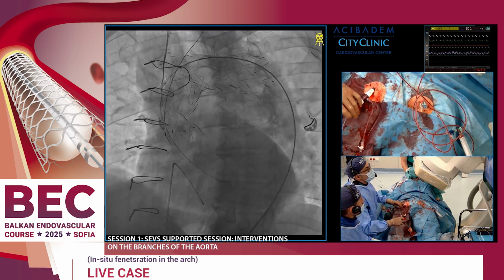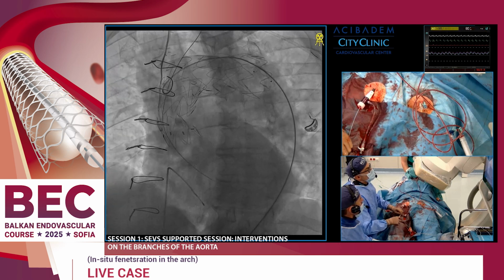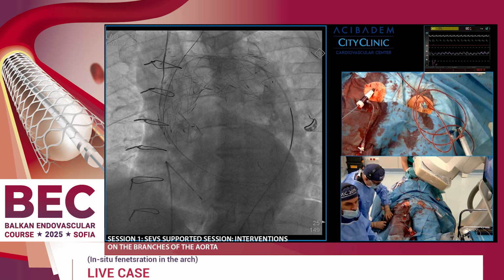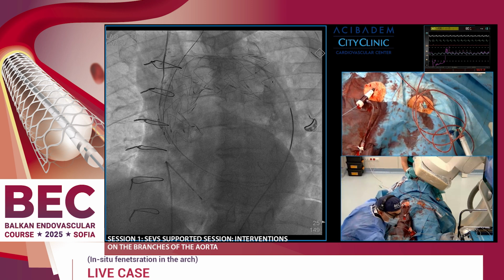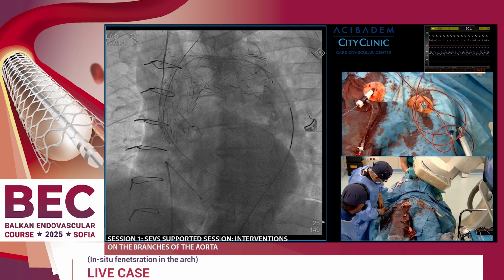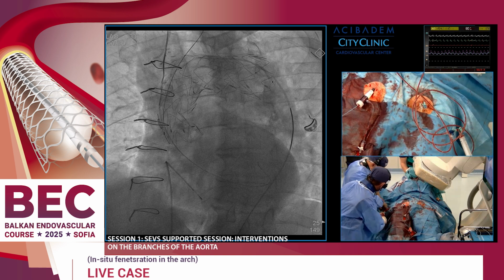Released. Excellent. Okay. Now I will connect the main arterial line to this pigtail. We are already, and now this is absolutely the truth regarding the ratio of the carotid pressure and the systemic. As I mentioned, we are providing around 70% of the systemic.